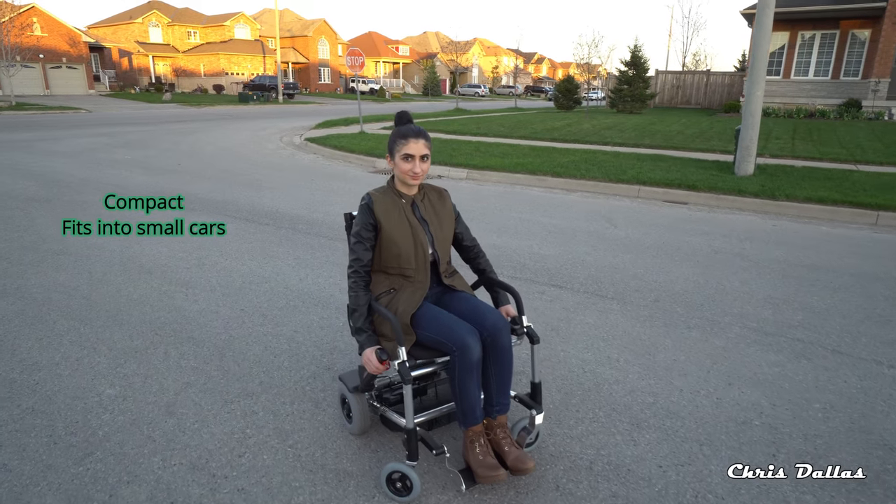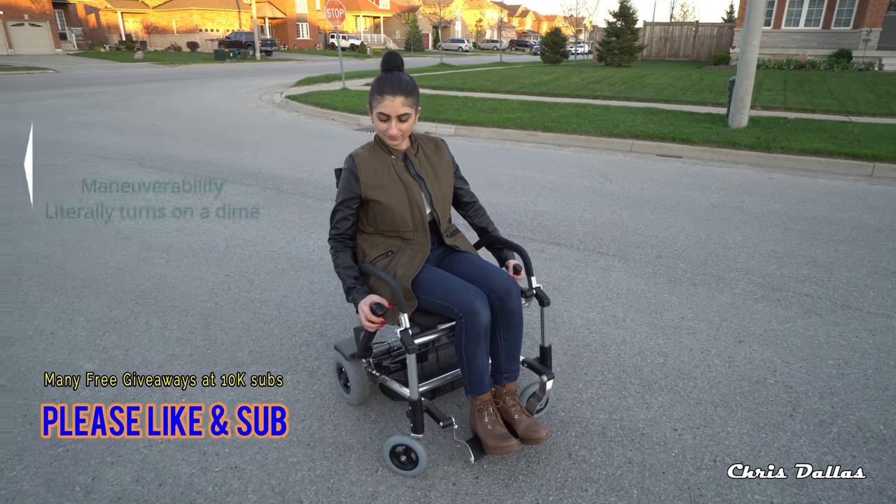Here we have the Zinger chair. This lovely young lady is going to demonstrate it. Her name is Areti.